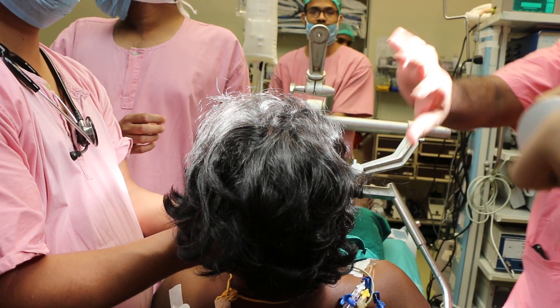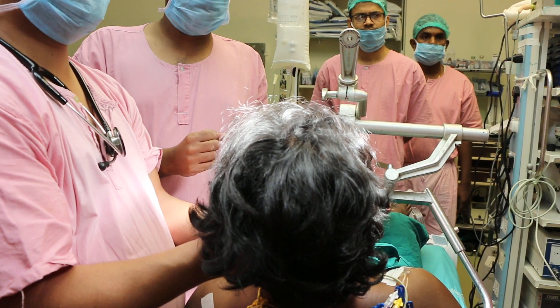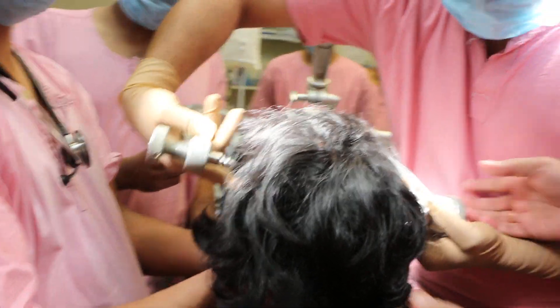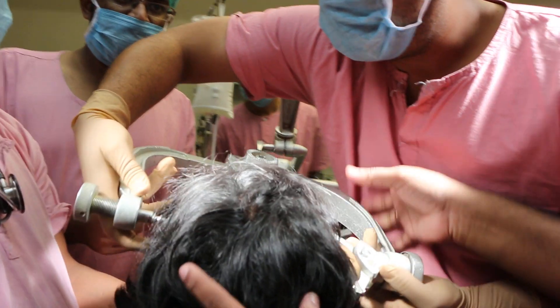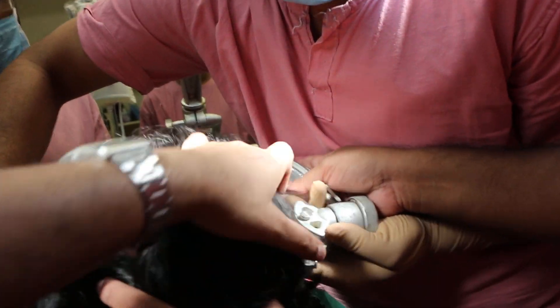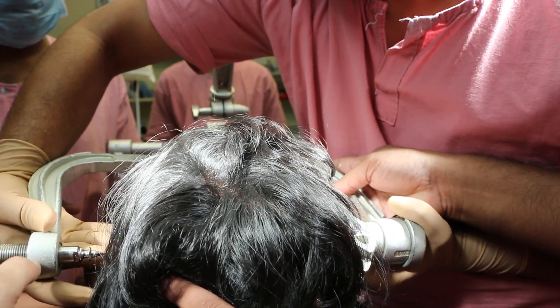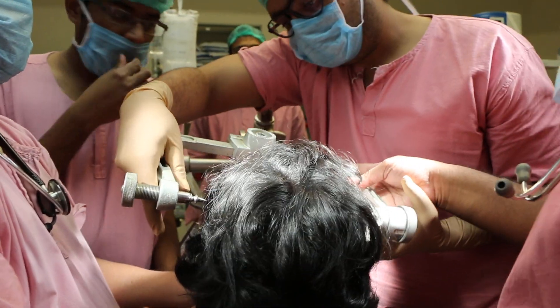Here we need a space. Here we need a space — just go below the parietal eminence. And this is below the parietal eminence. Don't go too down. This is a temporal region.